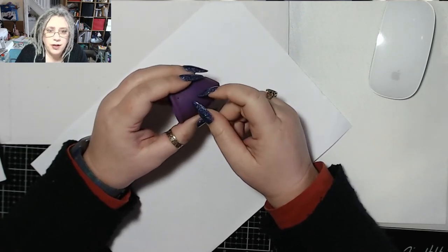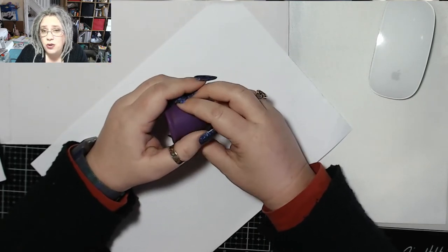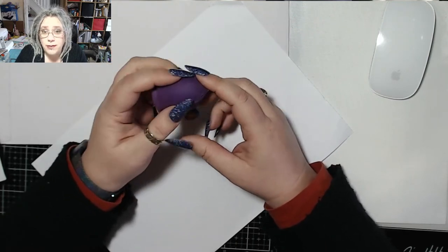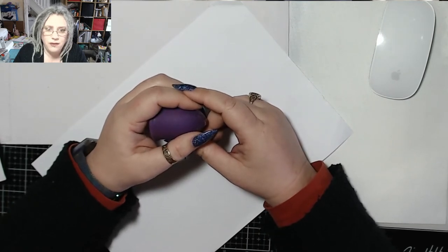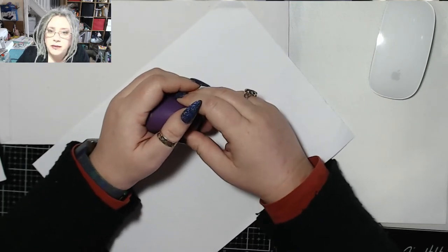Most cups also come with a drawstring bag, so you can sterilise your cup, stick it in the bag and then stick it in your purse. So if you know your period's due, like if I was out for the day, I would stick this in my handbag and if I'm out and about and I suddenly feel like it's starting, I can sort myself out — done.